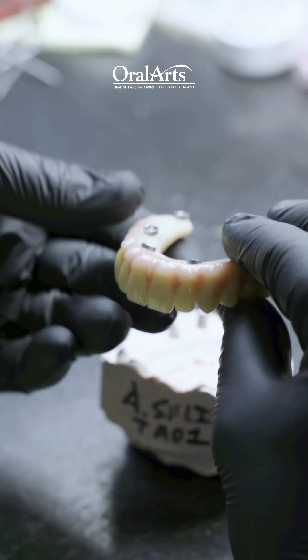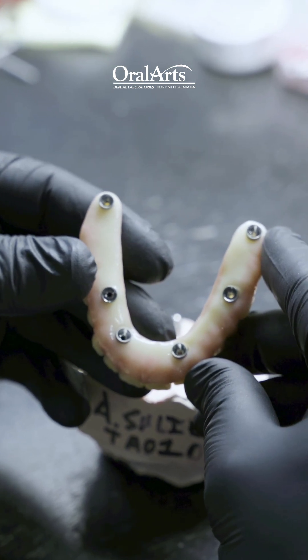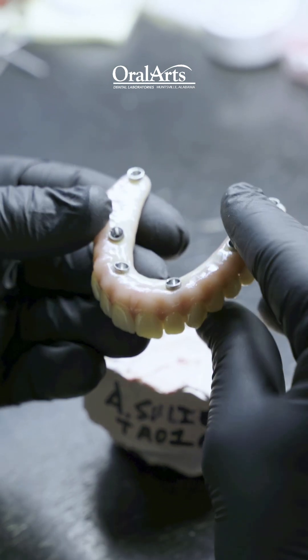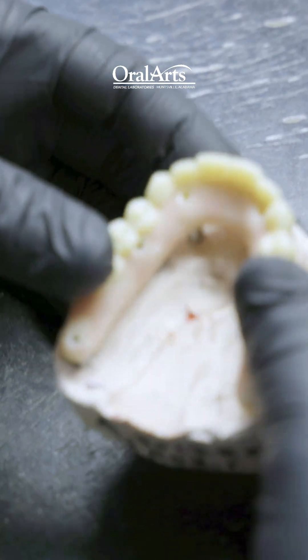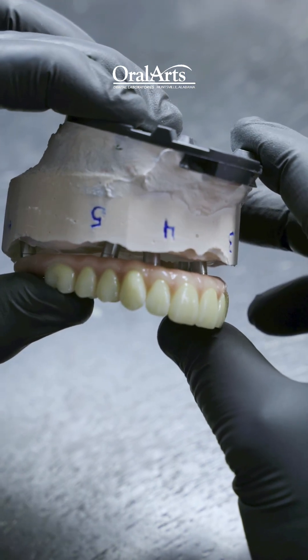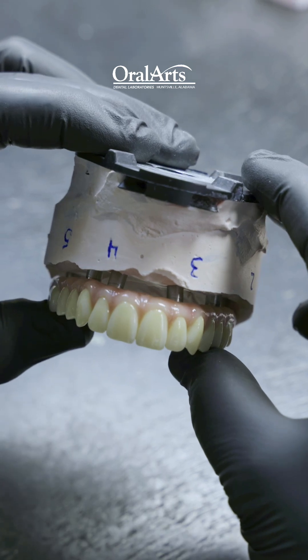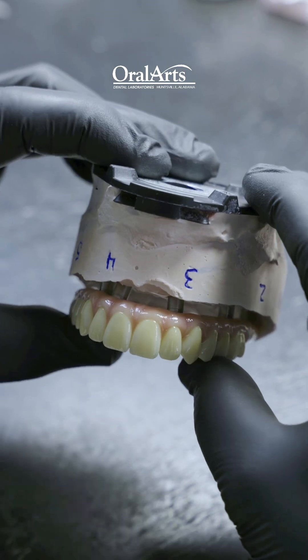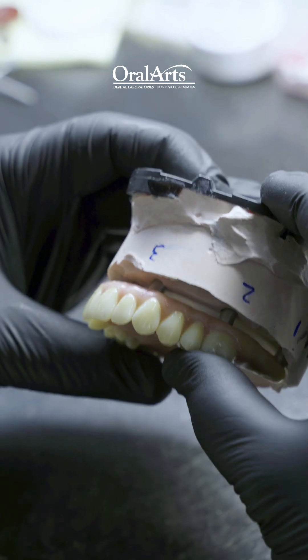We have the abutments cemented into place and have a wonderful fit to our model. This should go in the mouth without any kind of resistance — a nice and passive fit.